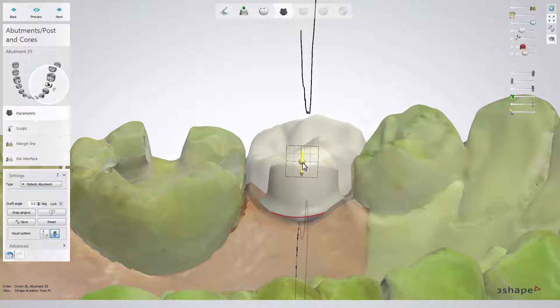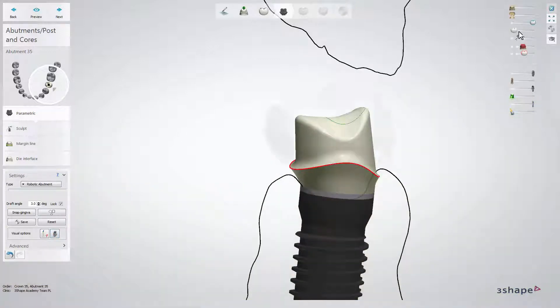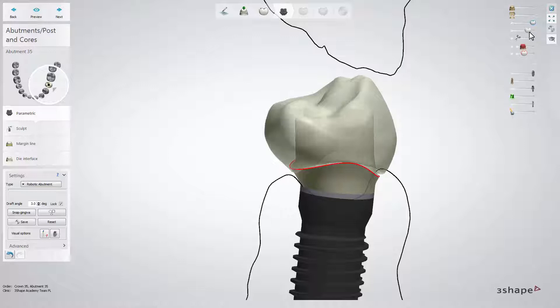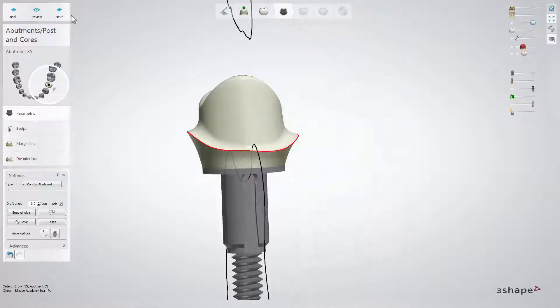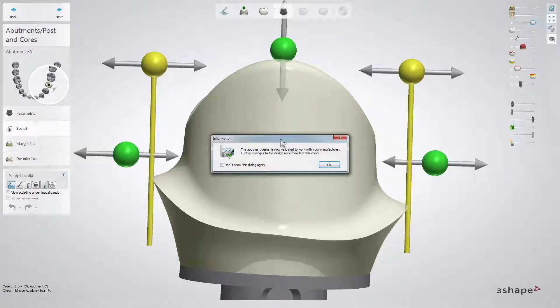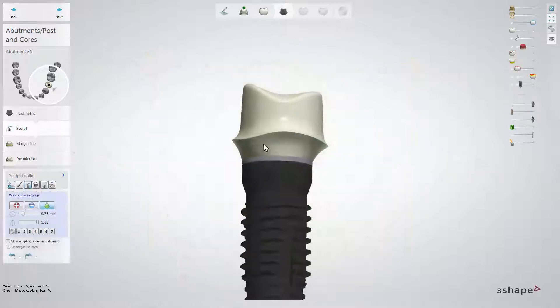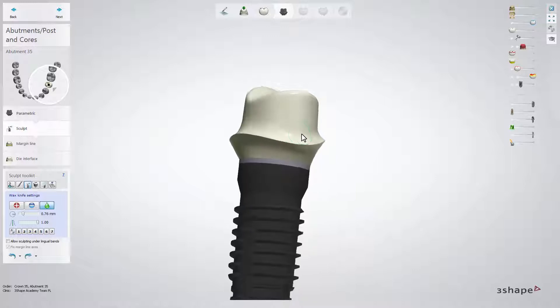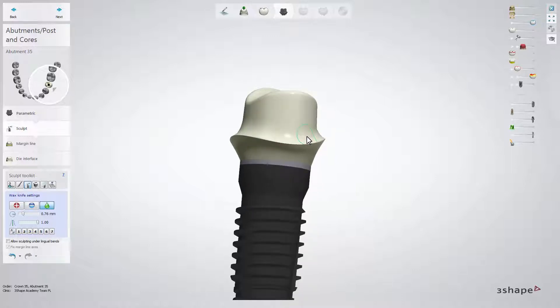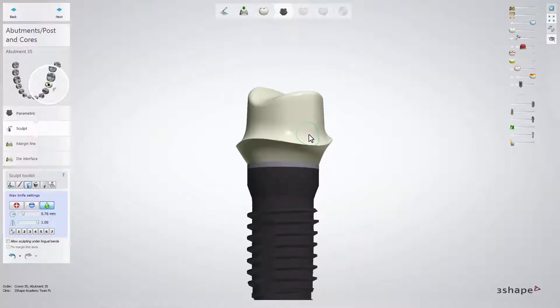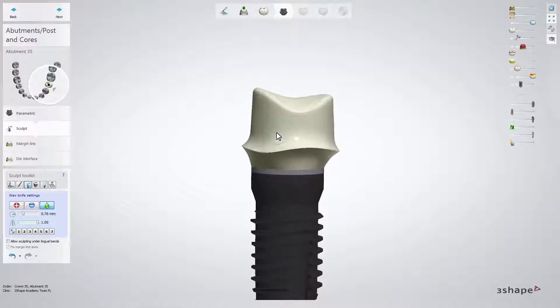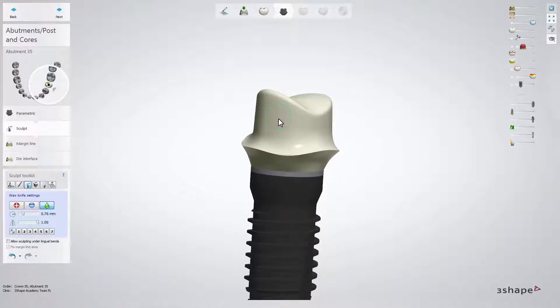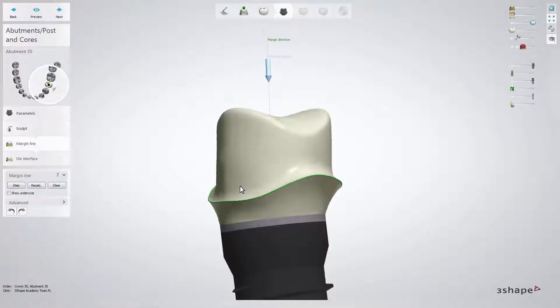Now, check the abutment design with your crown, and once your design is ready, click Next to have your design validated. Then click OK to enter Sculpt. Now you can use the sculpt toolkit tools to finally adjust your design, but be careful not to create undercuts, as this will result in problems later on.